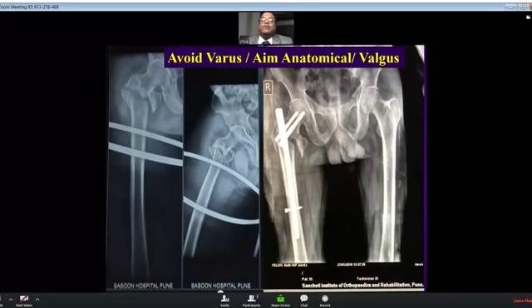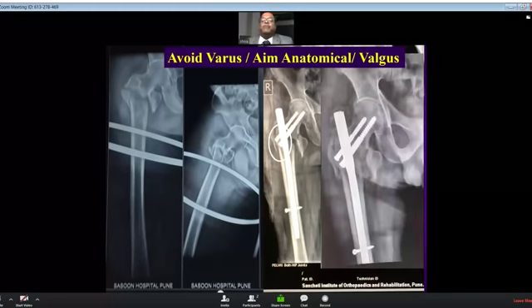So tighten the screw. The only problem here I find is because of the growth of bone over the lateral cortex or over the screw head, removal if required will be difficult. Then you have to dig this up or use a C-arm to get into the head of the screw and take this out. Otherwise, this gives beautiful lateral support. If there is a deficiency of lateral wall, you can use the technique without any problem. As I said earlier, you can see the beautiful consolidation just within a month's time in this case.